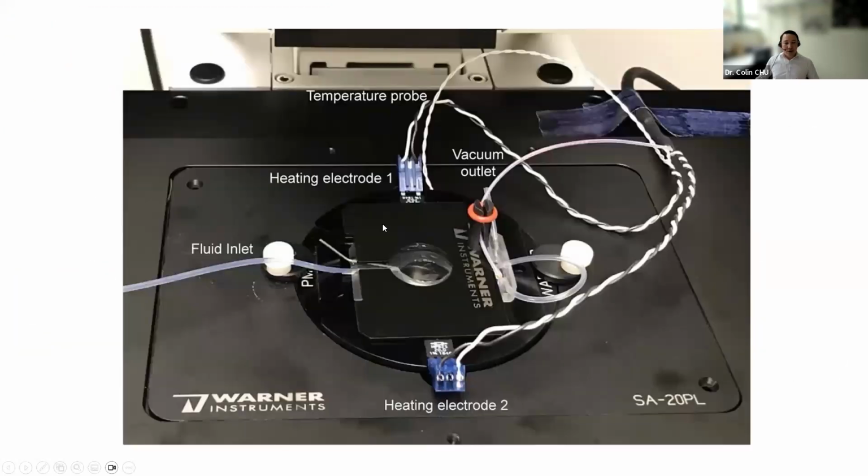And so this is how the final setup on the stage looks. We would have the fluid coming from the Aria on the right, filling up the chamber, being sucked out on the right, the fluid coming in on the left, sorry, and then heated to 37.